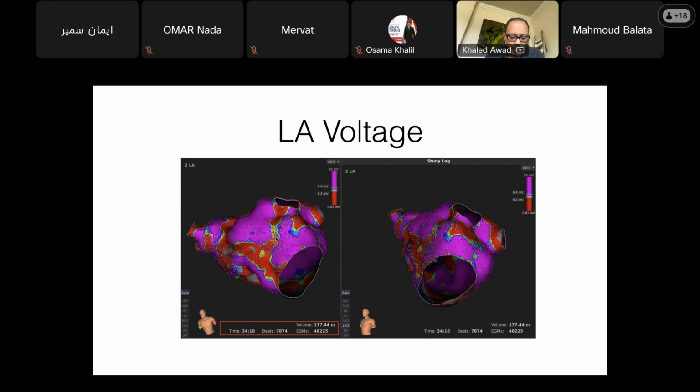I'm trying to remember the date I got this because I can go back and tell you. I actually do have the maps, and they were very, very impressive. I'll find them. I might just have to text it to you guys later. But essentially, it was very similar to this, but we also had to isolate a really good chunk of the anterior surface of the left atrium.